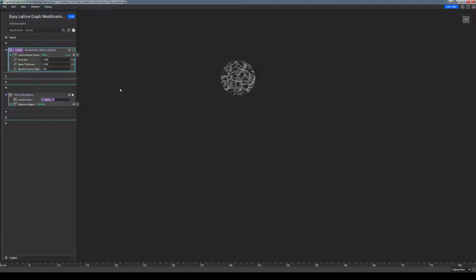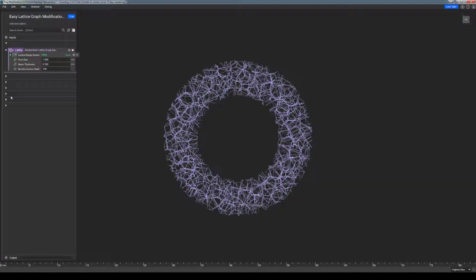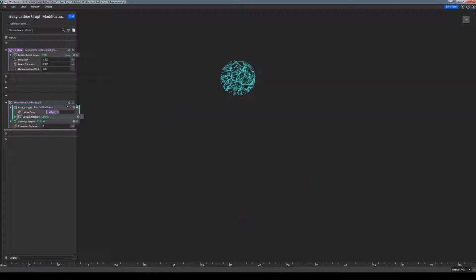Next in line, we actually have extend open beams. With this custom block, we can take a desired lattice graph like the one we have just trimmed, and extend the newly opened beams by a desired distance. If the user is looking to have all open beams be extended by a uniform value, then entering a scalar value will work just fine.